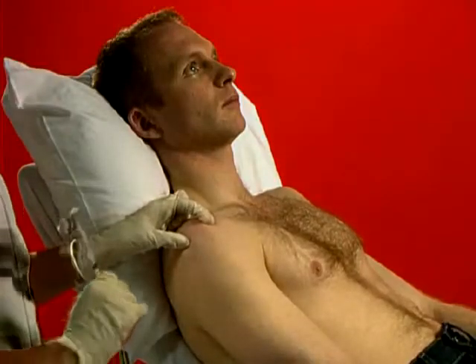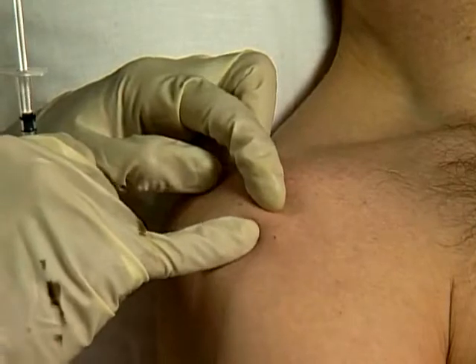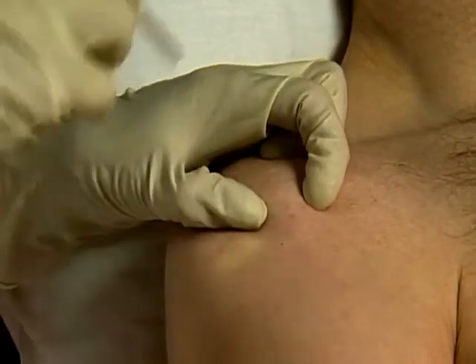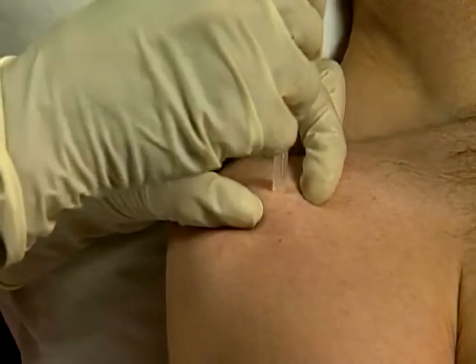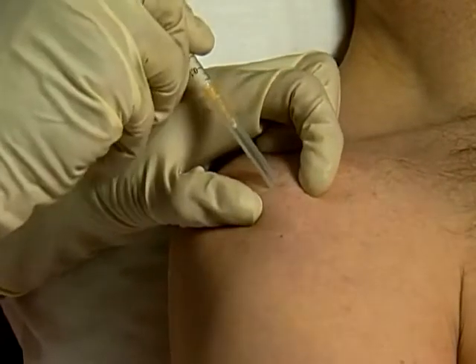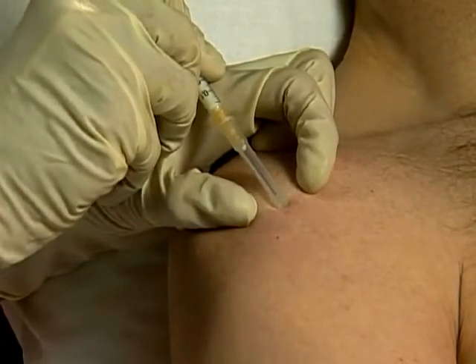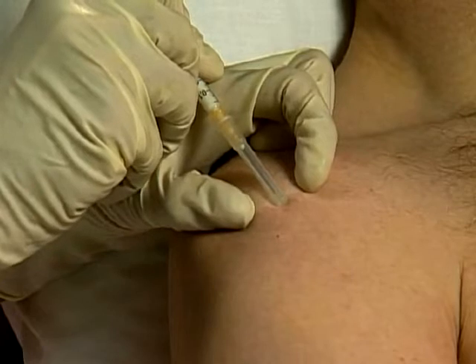Locate the bicipital groove lying anteriorly between the greater tuberosity and the lesser. Mark entry point at top of groove, clean and firmly stretch skin, and rapidly insert needle perpendicularly. Angle distally between tendon and sheath. Aspirate and inject as a bolus.